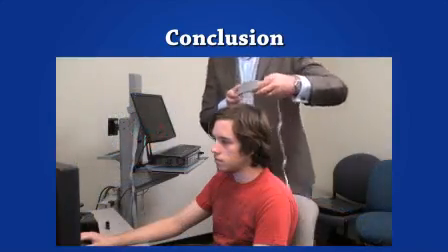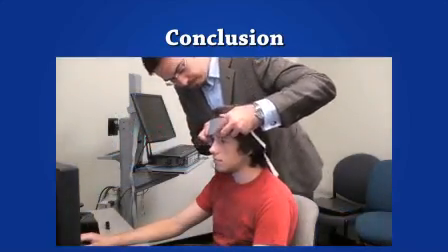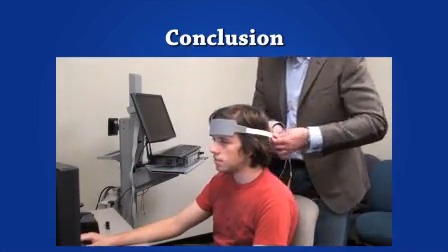fNIR is a portable, safe, and non-invasive brain monitoring tool that has been used in clinical, laboratory, and natural settings to study brain activation.